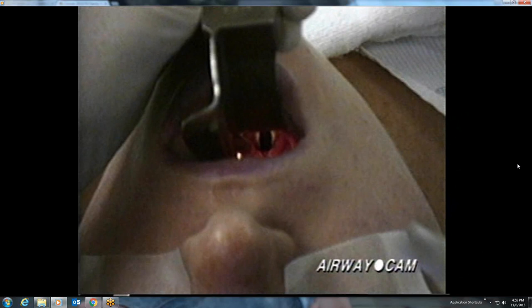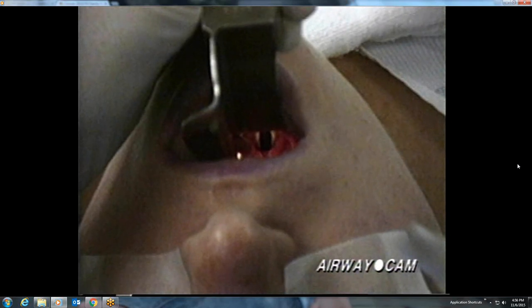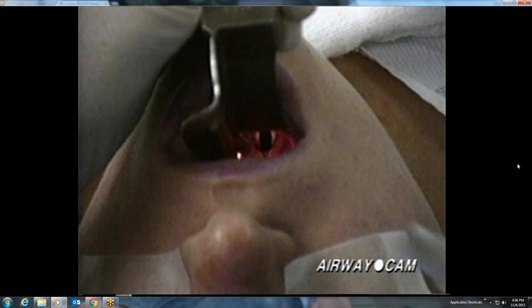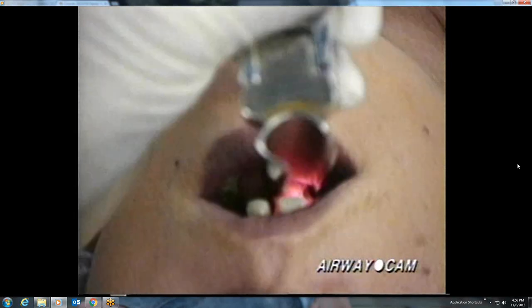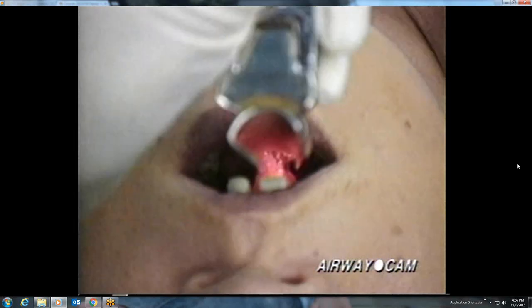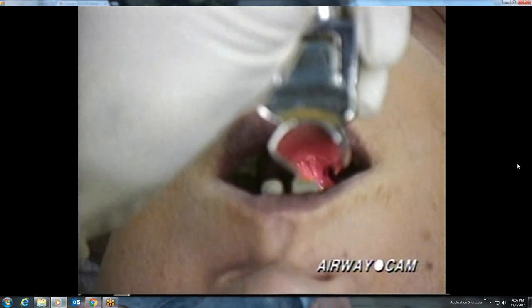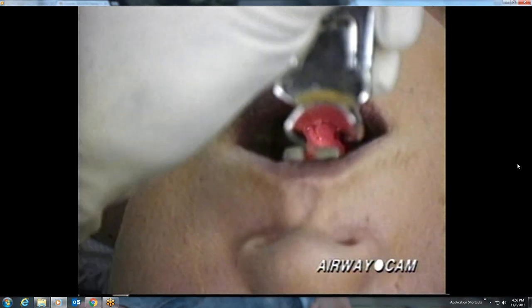Notice the rhomboid-shaped glottic opening, the bright white vocal cords, the posterior cartilages, and the interarytenoid notch.